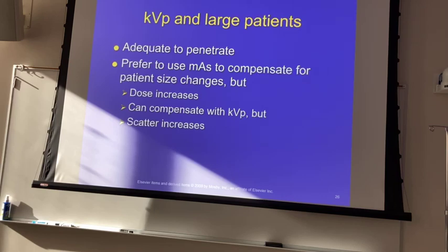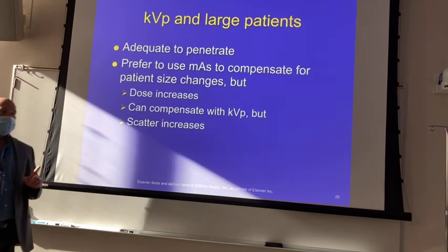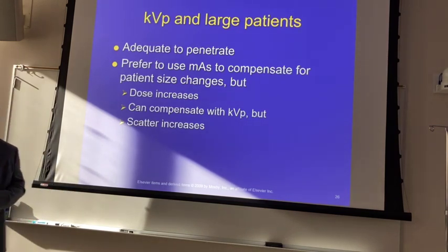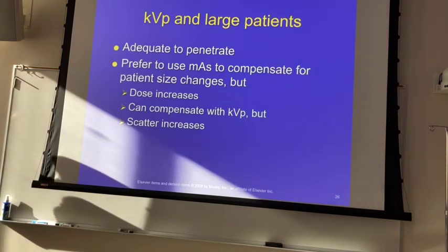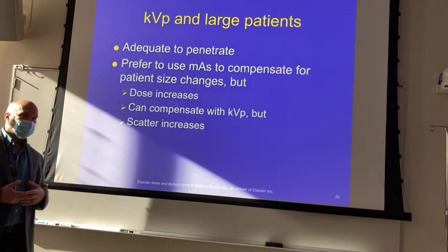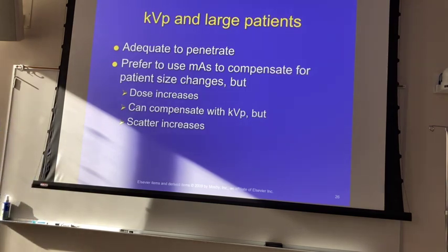And that was brand new as of January of this year. So theoretically, if they really get the registry updated, kVp should not be mentioned as an affecting factor for contrast on your exam. I'd recommend you not flush that, because sometimes it takes a while for the test to catch up to the literature.